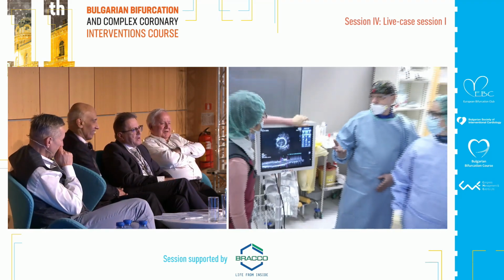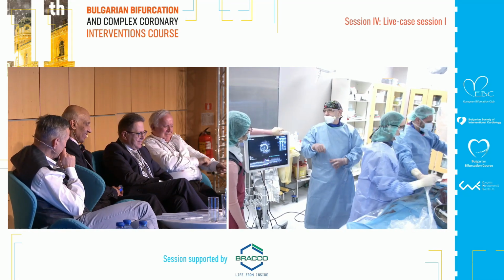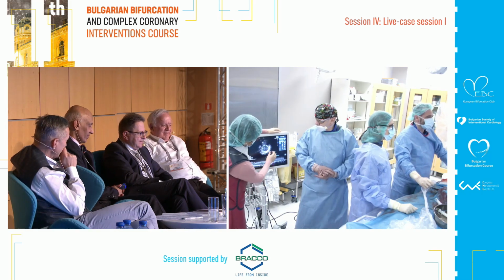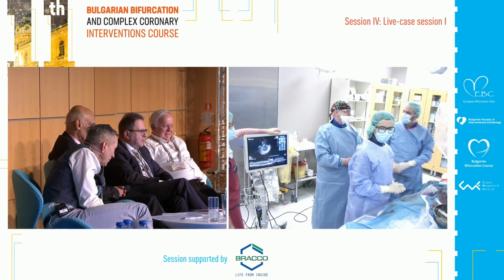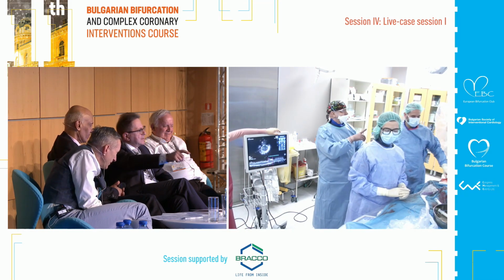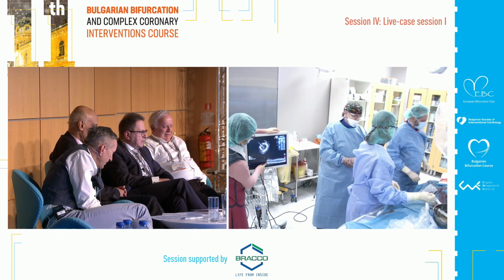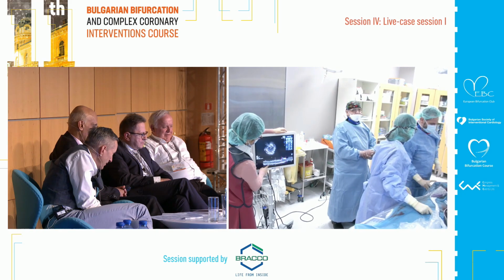I would suggest to use a bigger balloon for the minimum stented area. So just look at the IVUS. Look from the beginning of the stent, going towards LAD slowly, but not from LAD, but from the orifice of left main.